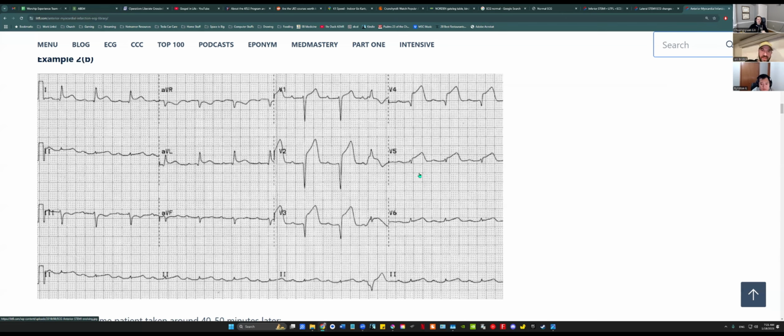Maybe he twisted his left ankle because he had a syncope from his heart attack. Yep, but he showed up because his ankle hurt more than his heart. But if on serial EKGs this starts changing to this shape, awesome. Call the cardiologist, sold.